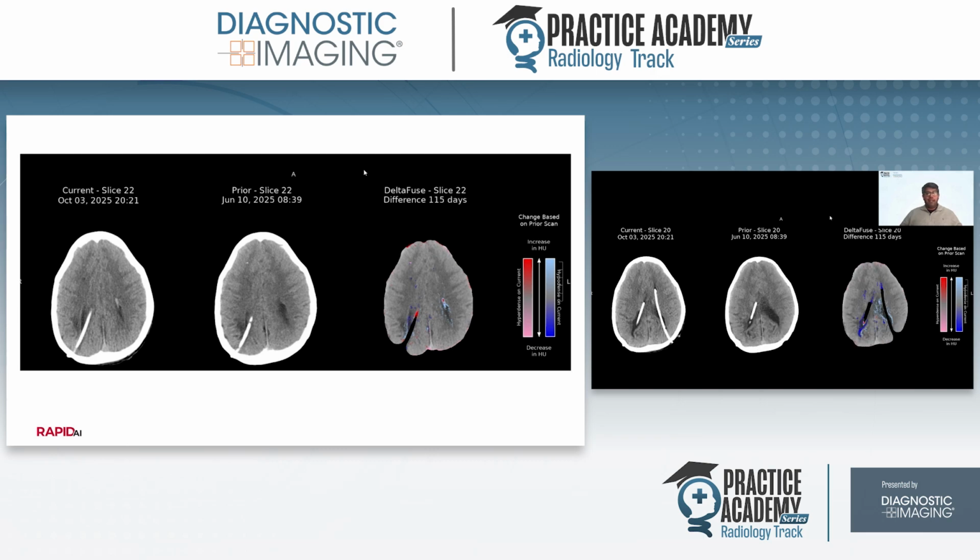I feel more confident that indeed the differences that I'm describing are real. Sometimes when the scan angles are so off, I'm not sure. I will say things like minimally increased to unchanged. And once you've lined it up, it gets rid of the ambiguity that exists in my head surrounding the different subtle changes that happen.